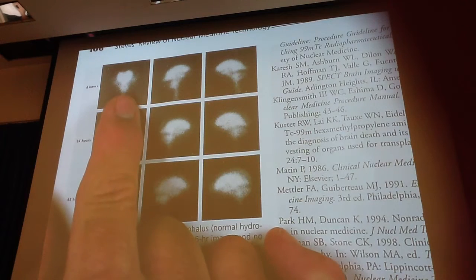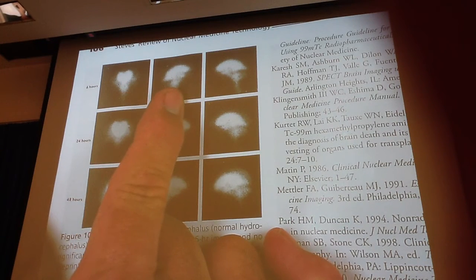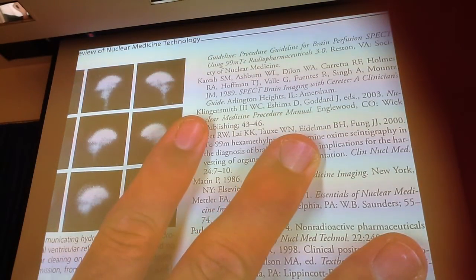The other thing is, whenever you do this procedure, you always want to make sure that you don't let the patient raise their head up. You always try to keep the head down lower than the rest of the body, at least until the pressure builds back up on the inside of the subarachnoid space in the brain. Because we don't want the brain getting sucked down into the bottom and you become a politician.